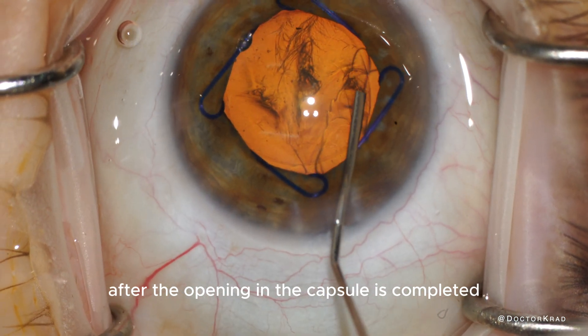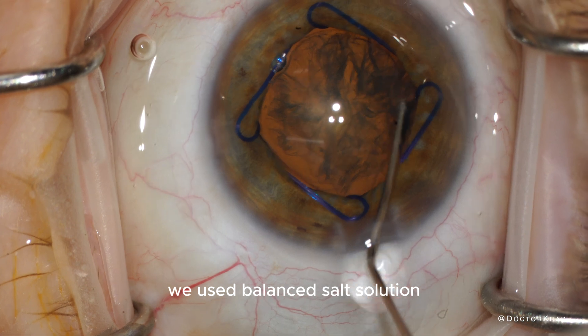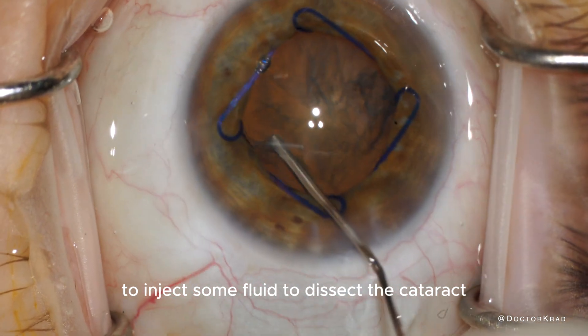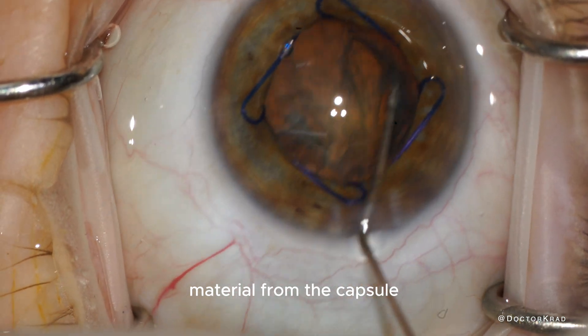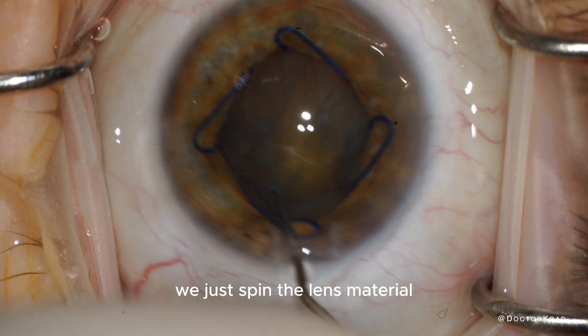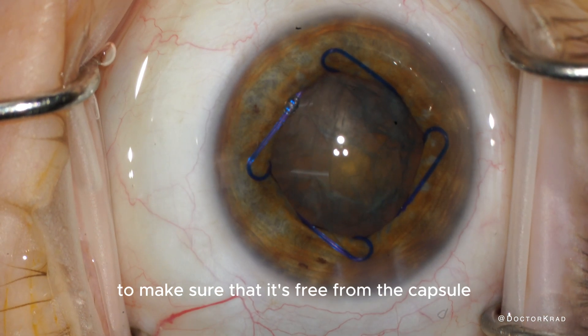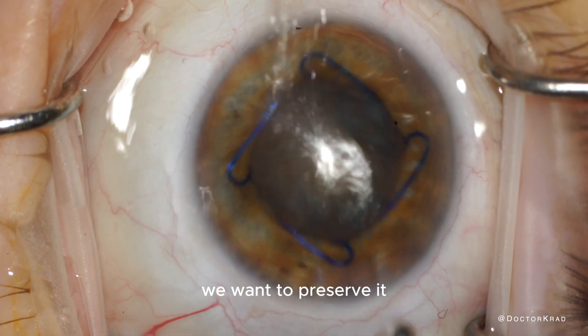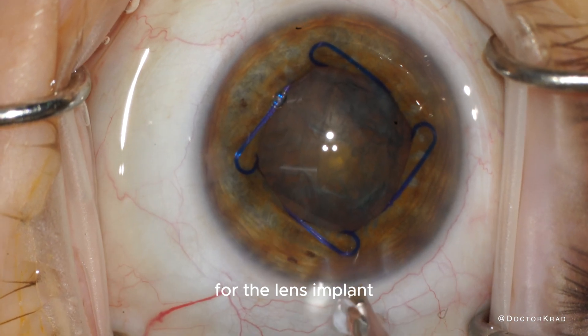After the opening in the capsule is completed, we use Balanced Salt Solution to inject some fluid to dissect the cataract material from the capsule — it's called hydrodissection. Then we spin the lens material to make sure it's free from the capsule. We want to preserve the capsule because that's going to serve as the new home for the lens implant.